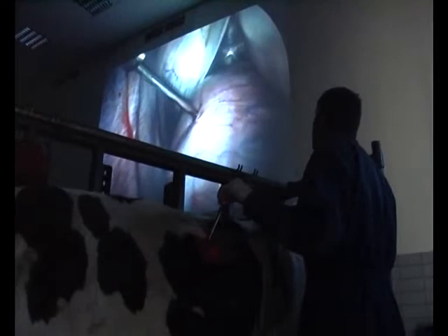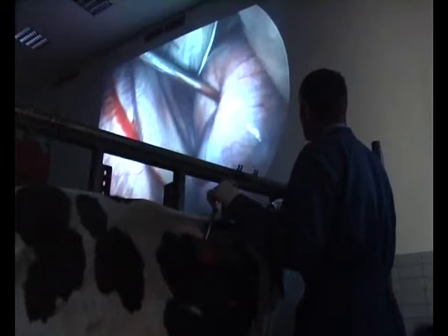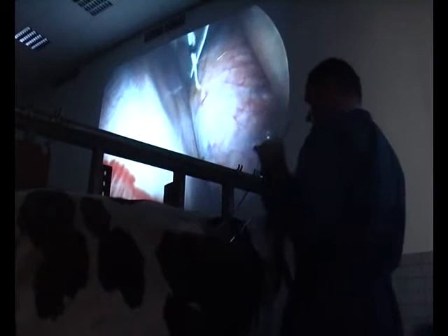You can see perfectly the edge of the omentum and also the curvature of the rumen. And you see the ruminants working. And it sinks down. And if it doesn't sink enough, you push here with your hands or your knee. Pull, then the fluid starts, it stops, there's a blockage very fast. Yep.